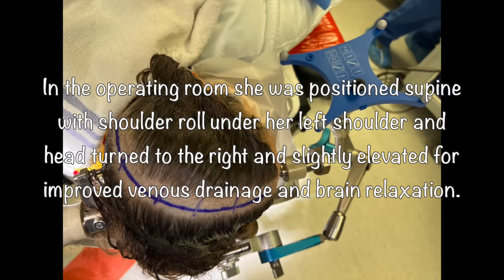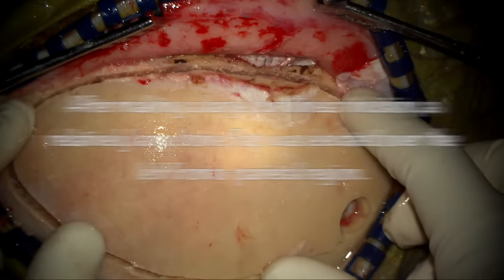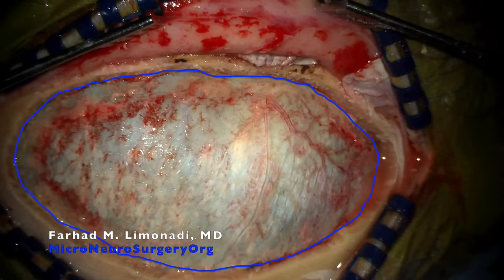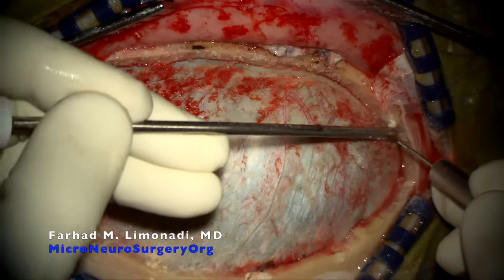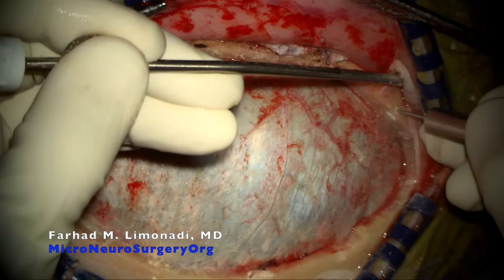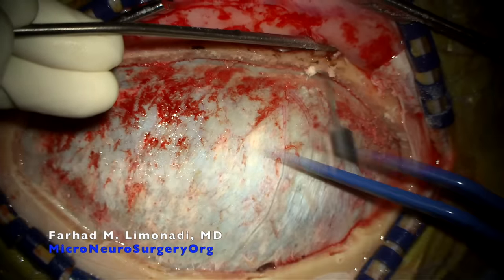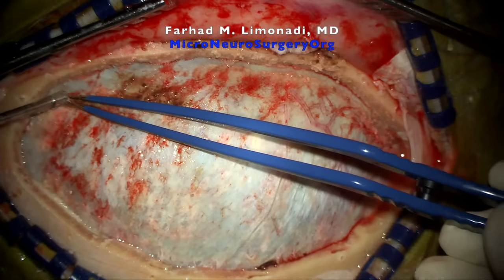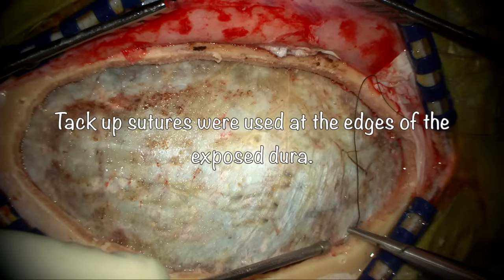In the operating room, she was positioned supine with a shoulder roll under her left shoulder and head turned to the right and slightly elevated for improved venous drainage and brain relaxation. After making a large curvilinear incision, a relatively large bone flap was elevated over the left frontoparietal region. Bipolar cautery was used to cauterize the branches of the middle meningeal artery. Tack-up sutures were used at the edges of the exposed dura.